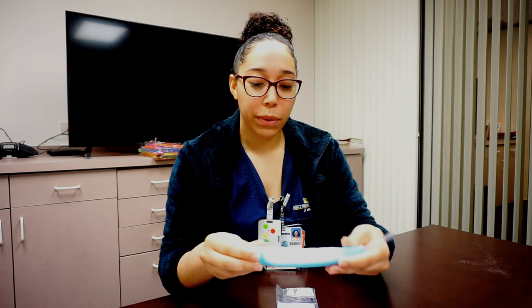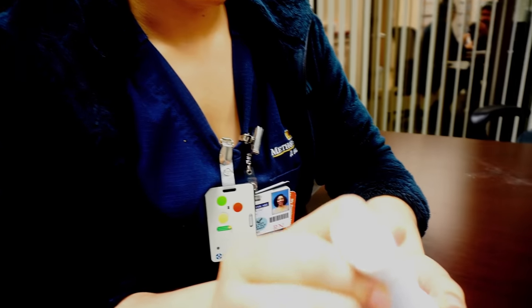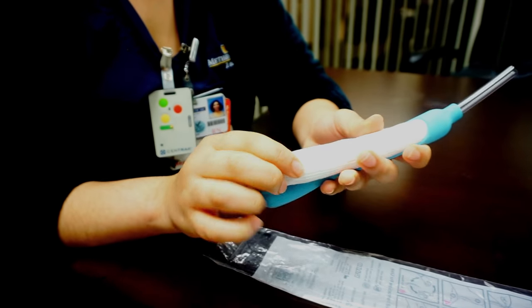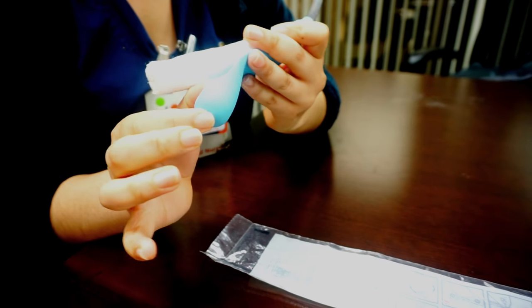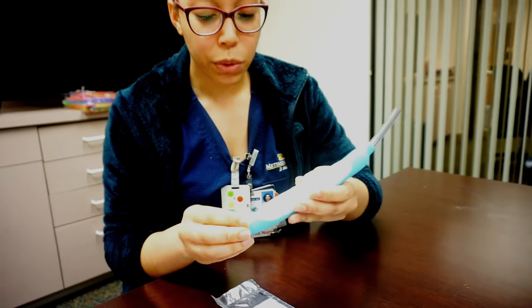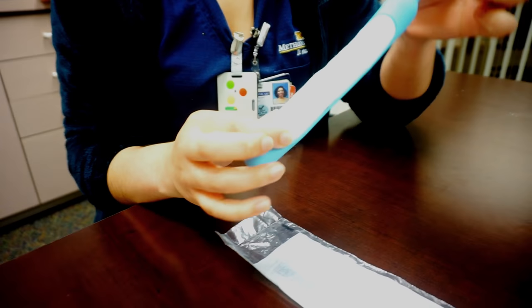This is the Purewick catheter. It has some foam on it and a little gauze coating. This is where the urine is absorbed from the patient, and it also has a little collection chamber on the bottom of it. The way that it works is once the urine is absorbed, it pools in the bottom of this chamber and then it is sucked up through the tubing.